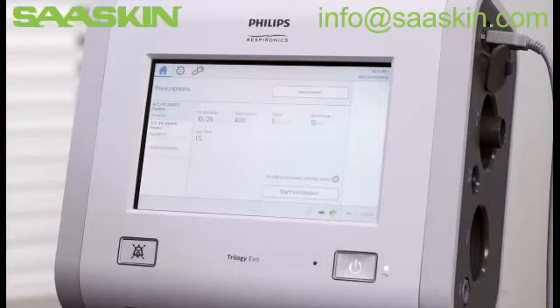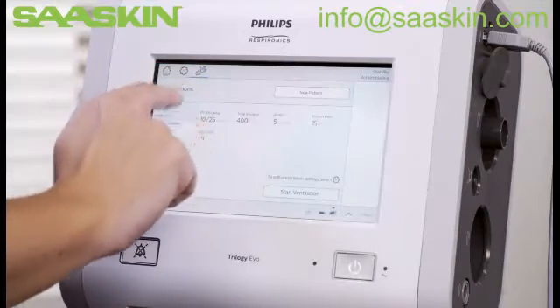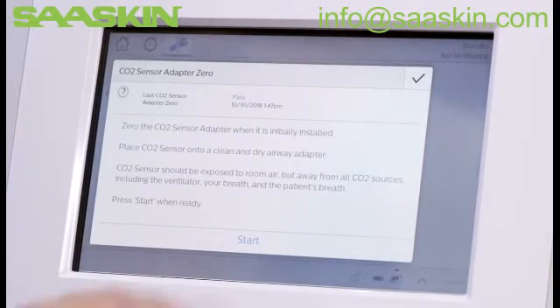The recommended procedure is to calibrate the airway adapter prior to use. To do this, go to the Options menu, tap Calibration Setup, then CO2 Sensor Adapter 0, and follow the on-screen prompts.